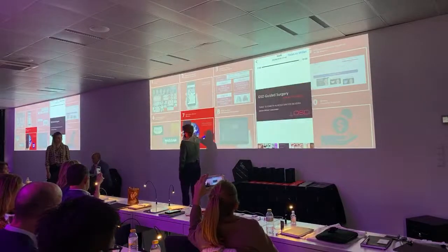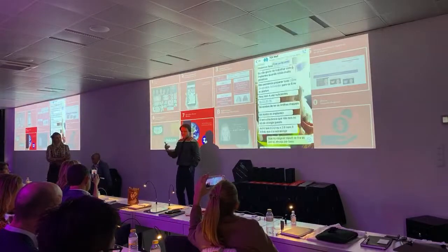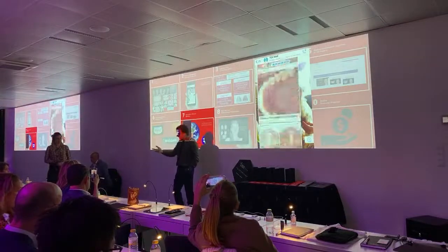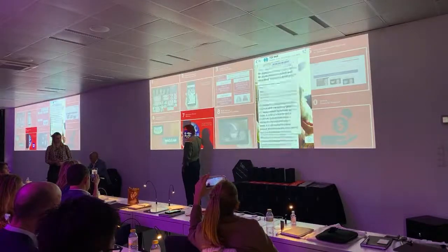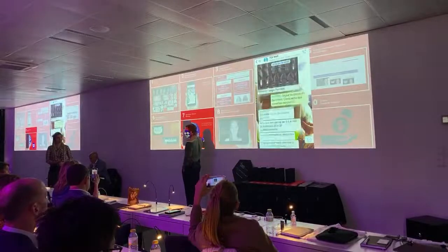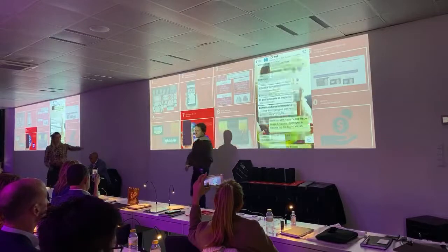This step 7 means going back to the planning center and asking them to modify the plan. Modify the ortho, modify the implant, modify the crown lengthening, modify the bite, modify whatever is necessary to get a second presentation with new videos, and then share again with the specialists, get their approval, everybody on board, this is what I'm going to present to the patient, and then step 7 ends.